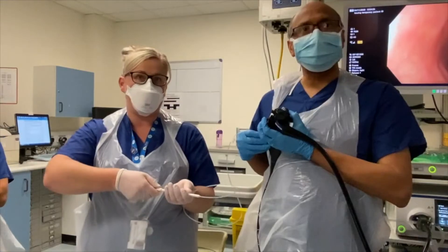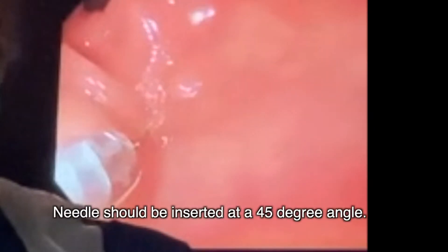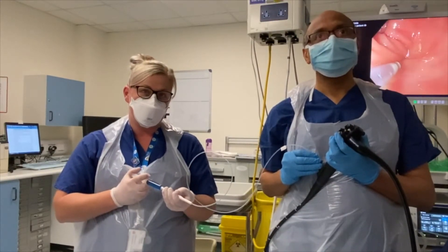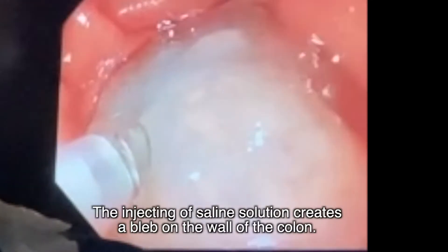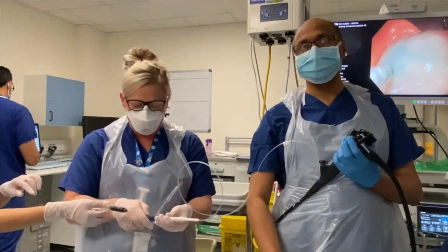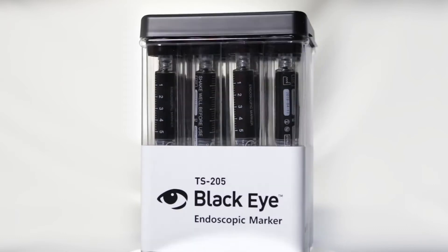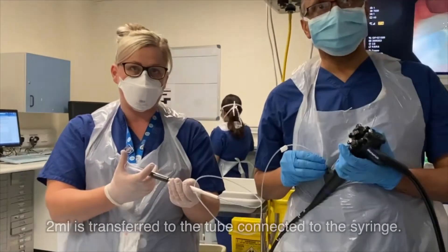We will inject and create a submucosal bleb with a normal injecting solution. Needle out. We are going to use a tattoo now — black ink, which gives very good tattooing. Now I will put my needle back into this bleb and inject the tattoo.